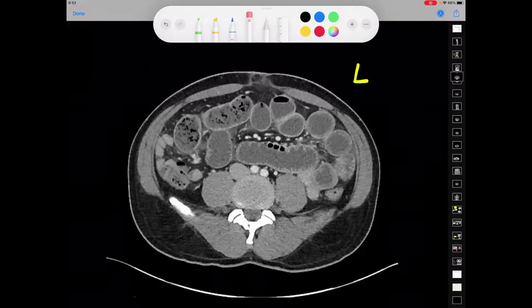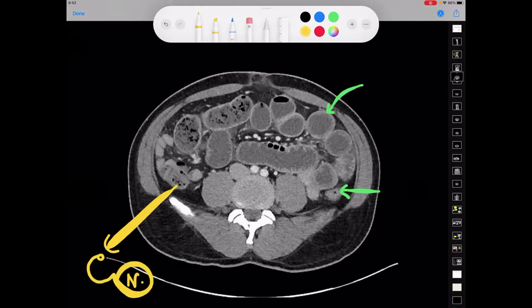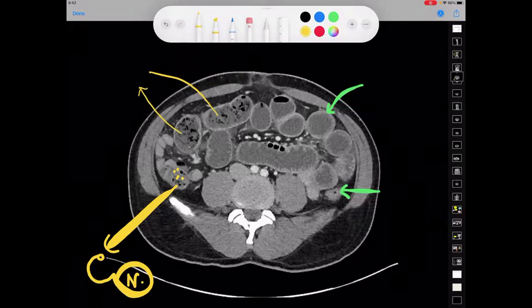You can see that the left colon is collapsed — this is the left colon which is collapsed. When you see loops of intestine appearing dilated, their walls are still enhancing and you can get ring-like pictures. What is very interesting is this sign: the cecum normally contains fecal matter, and it is absolutely normal for the cecum to contain this kind of matter — those dot-dot-dot things called fecal matter. But on the other side, the small intestine also contains fecal matter.